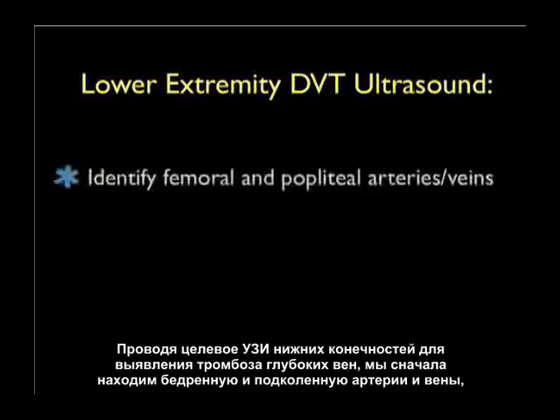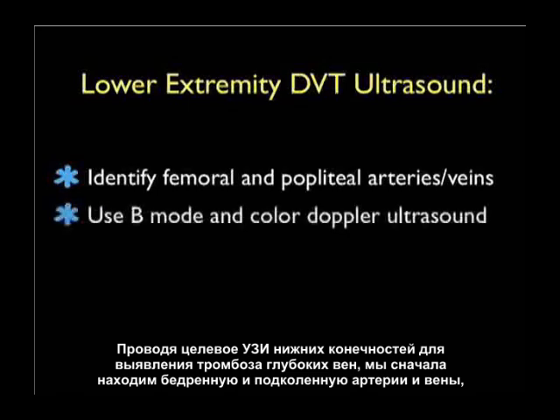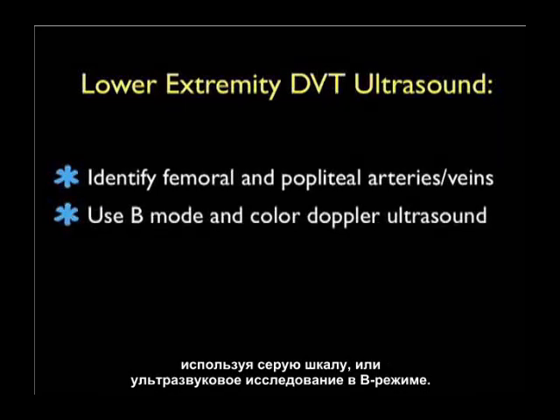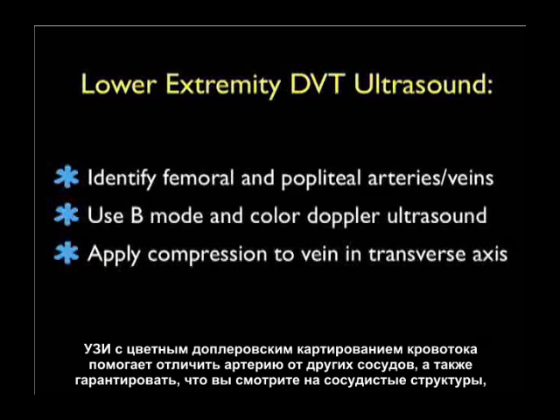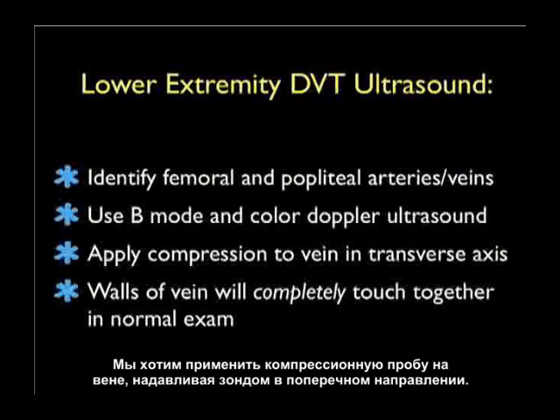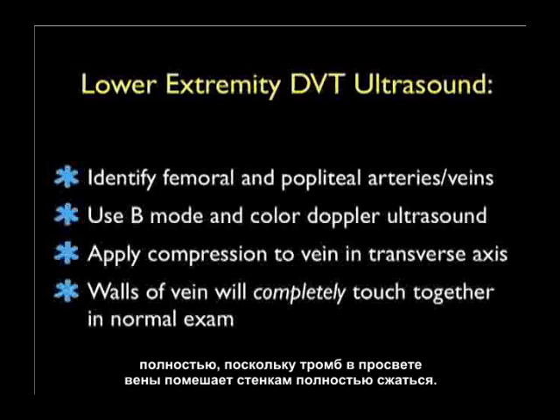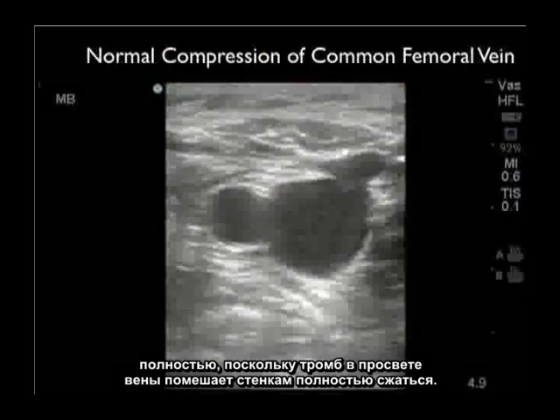When performing the focused lower extremity DVT ultrasound examination, we first identify the femoral and popliteal arteries and veins using B-mode or grayscale sonography. Color flow Doppler can be helpful in differentiating artery from vein, but most of our information will come from B-mode sonography. We apply compression to the vein pressing down with the probe in the short axis or transverse orientation. In a normal examination the walls of the vein will completely touch together; if a DVT is present, a thrombus within the lumen will prevent the walls from completely collapsing.